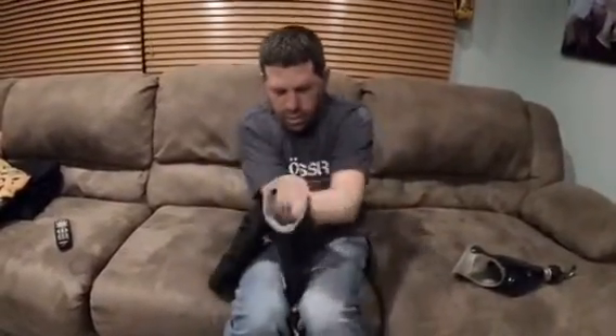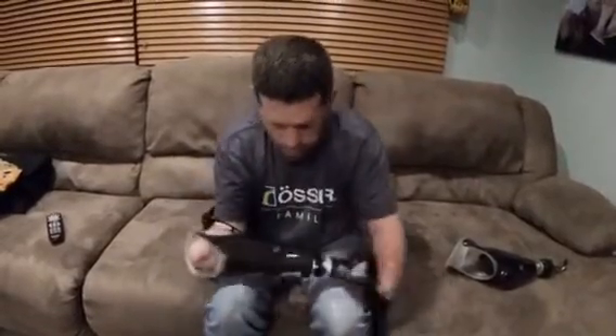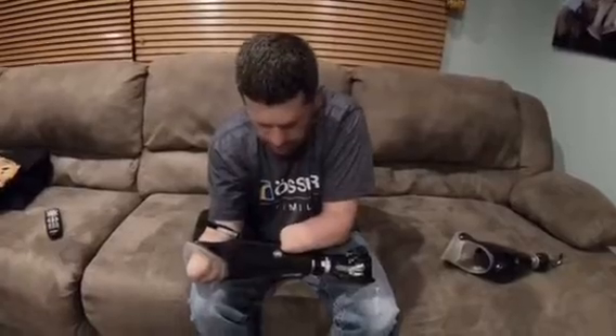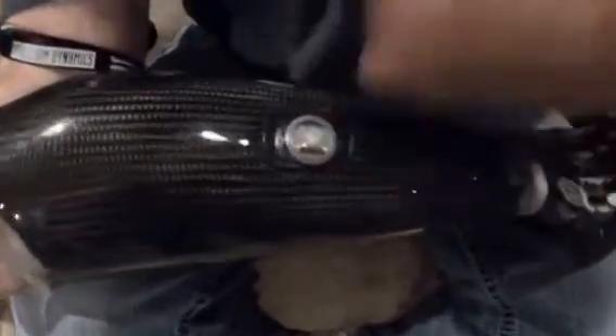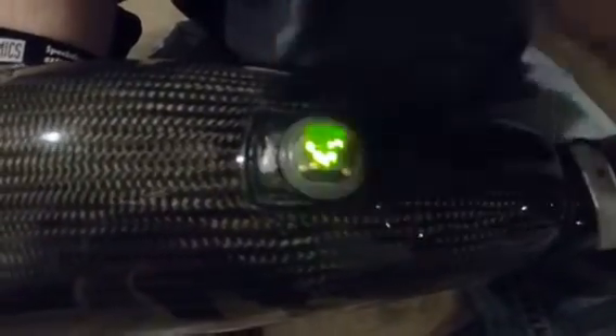An amputee asked me how I can turn this hand on with my residual limb. This is also an Össur Touch Bionic on/off switch. Basically, the black piece right there is how you turn it on and off — you hold it in with my knob and it's on.